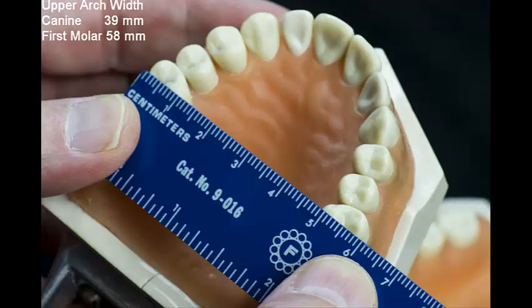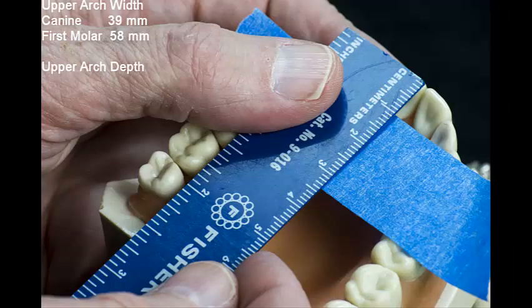Next, I will measure the dental arch depth. This measurement is defined as the perpendicular distance between the central incisor contact point and the centers of the interdental widths. I begin by placing a piece of tape over the presumed canine bracket points, and place a light mark on the masking tape indicating the centered arch width.